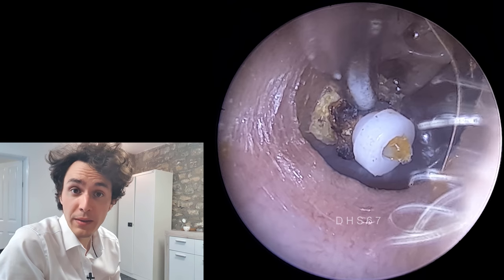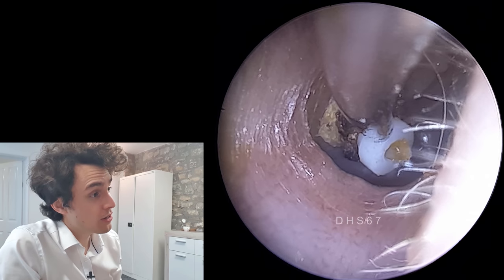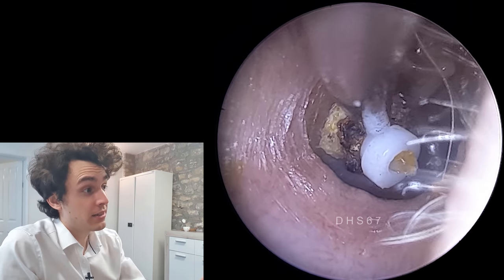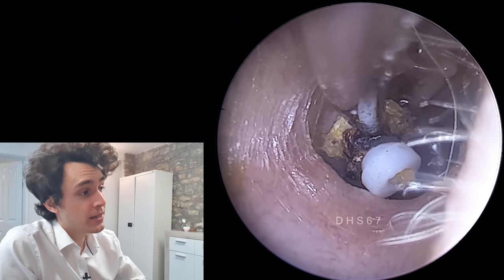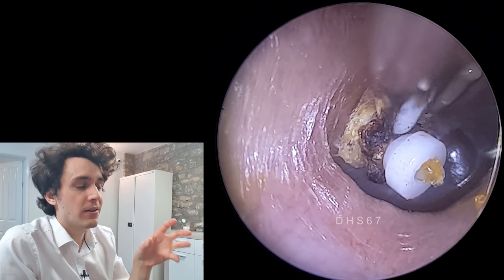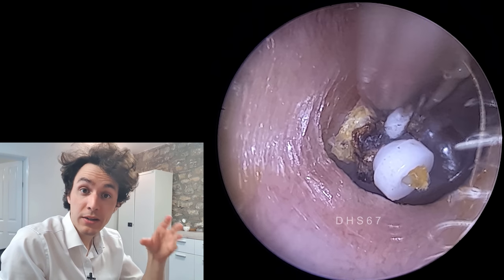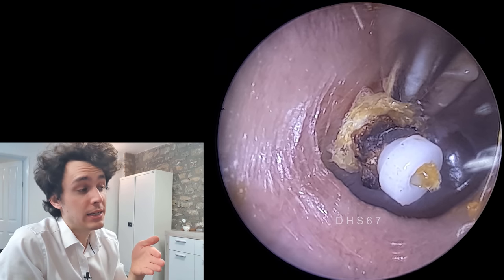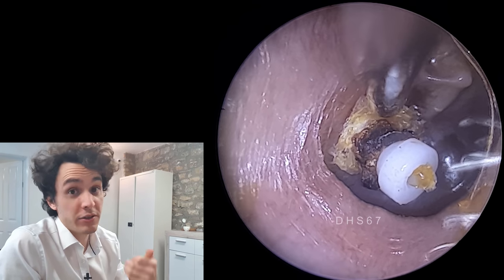So in other words, there's congestion behind the eardrum. There's negative pressure. There may be a buildup of fluid, like mucus, behind the eardrum, which the surgeon will suction away and then insert the grommet. It's essentially a bypass — the middle ear isn't getting ventilation properly from the eustachian tube opening and closing, so there's a mechanical opening to the middle ear, which is the grommet.